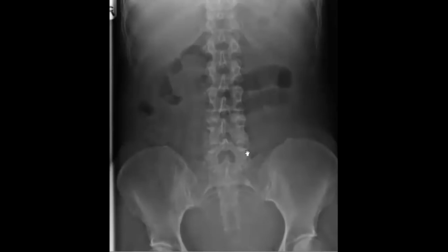And there is no gas in the large bowel, as I see in the answer of Ala. Now Huda also perfect. Nermeen, nice. So now you will go to the differential.